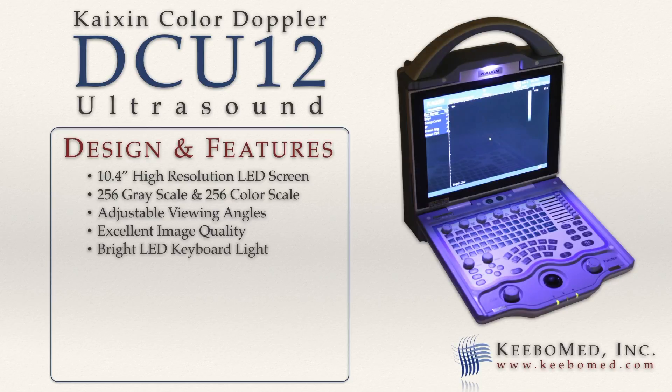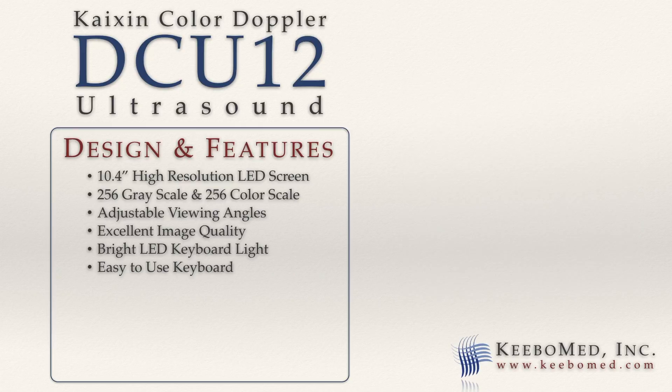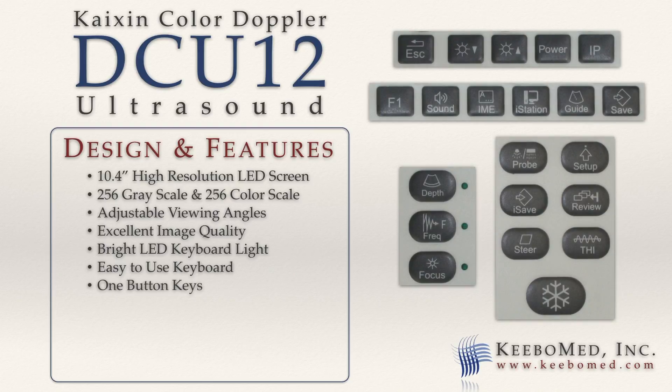A bright LED light allows for clear viewing of the keyboard in darker conditions. The keyboard is easy to use and includes multi-functional knobs for quick adjustments and many one-button keys, including image storage, image review, and printing.